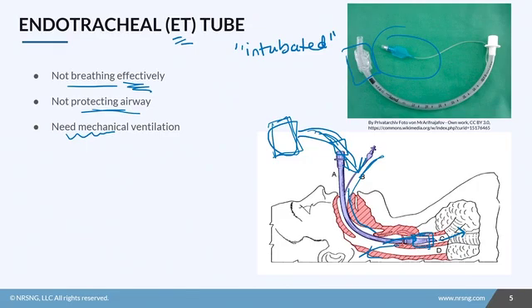This is what you use to inflate that cuff, and you have to protect this at all costs. If it accidentally gets cut or broken or pulled, this balloon is going to deflate and you're losing your airway. You have to replace the whole tube.